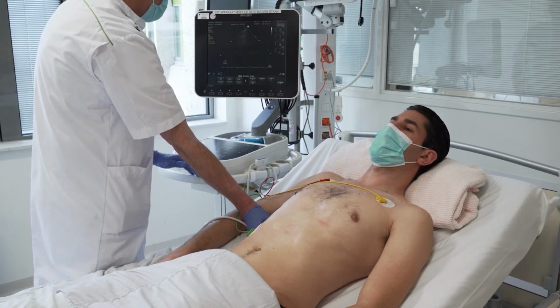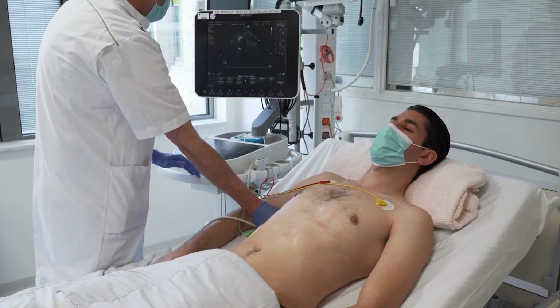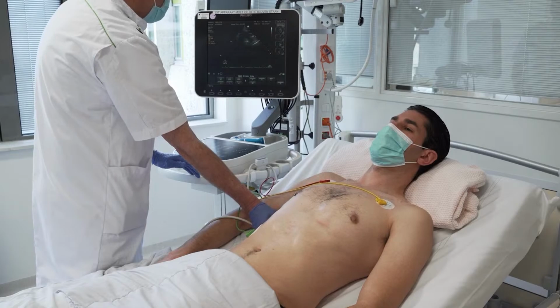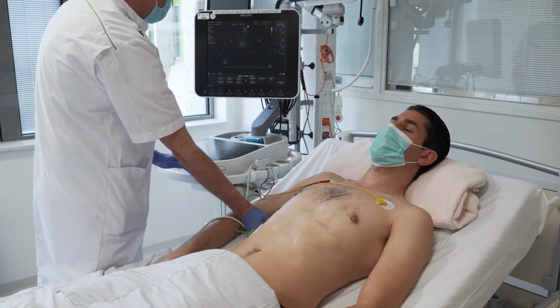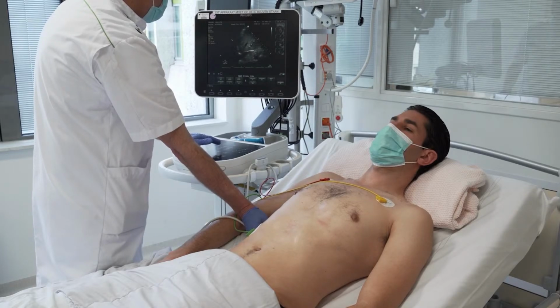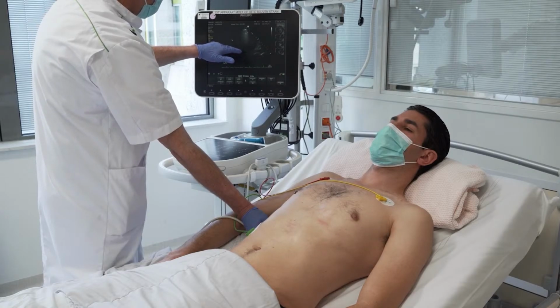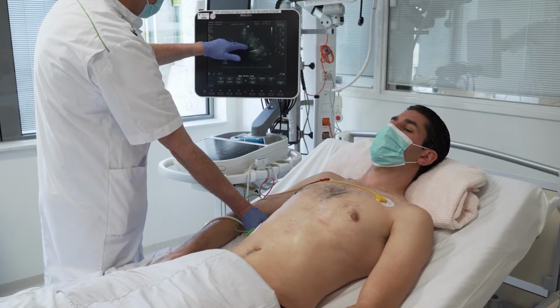I'm moving it from cranial to caudal. Normally the lung is air, so I will see absolutely nothing, but what I'm looking for is the liver and the diaphragm. And I'm playing with the depth right now, and now is the view I want to have. So this is what I want to see. I want to see the diaphragm here, and I want to see the liver.